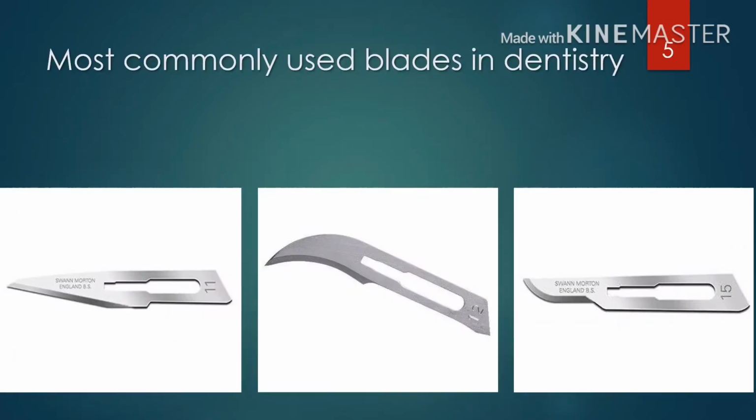Most commonly used blades in dentistry are these, number 11, 12, and 15. We mostly use these because of their size. Their size is relatively small, which makes them good for intraoral use.